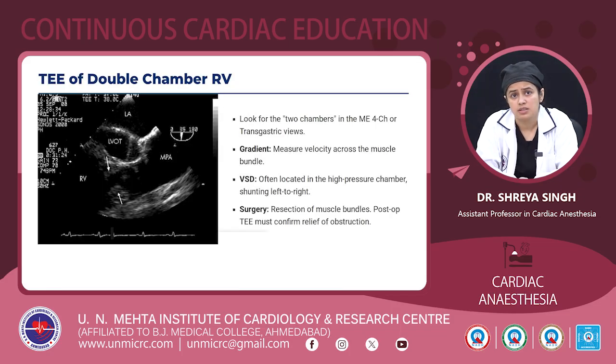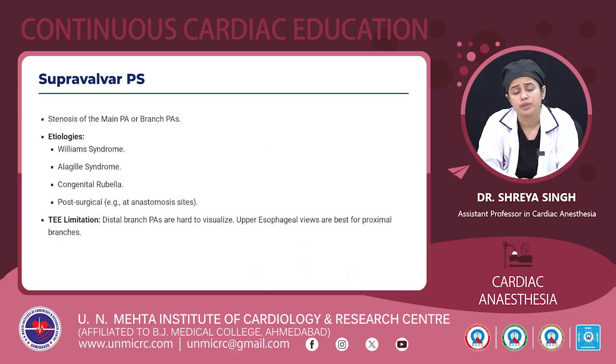So this is TEE of DCRV. So we can look for two chambers in the mid-esophageal four-chamber or transgastric views. We can measure velocity across the muscle bundle. VSD is often located in the high pressure chamber, shunting usually from left to right. And so in surgery, we usually resect the muscle bundles, and post-op TEE must confirm the relief of obstruction in these cases.